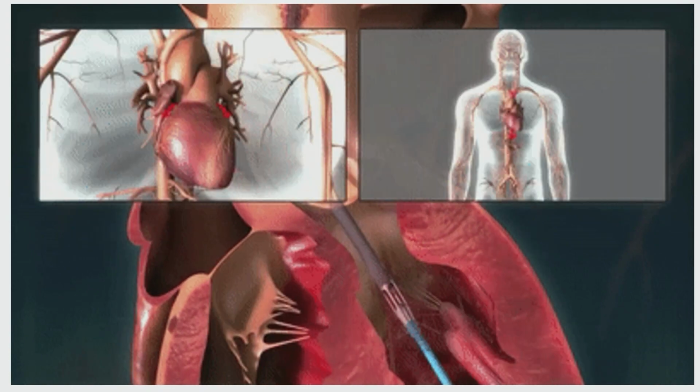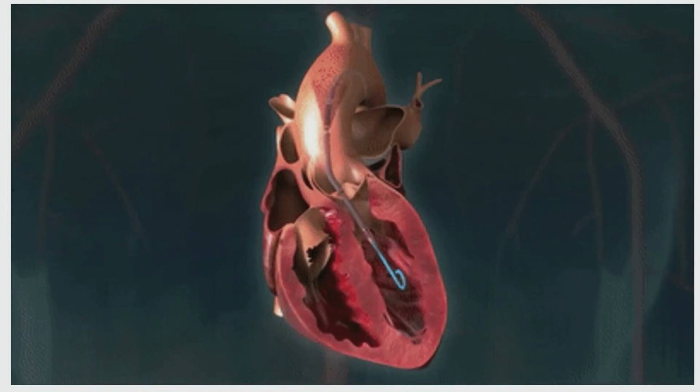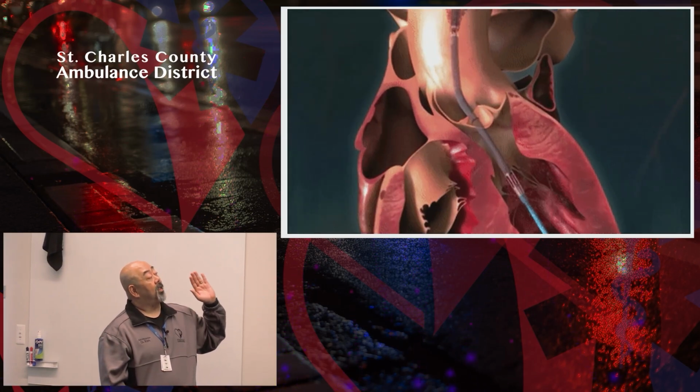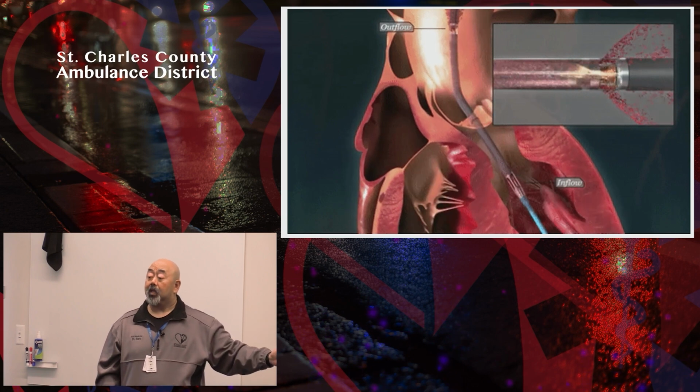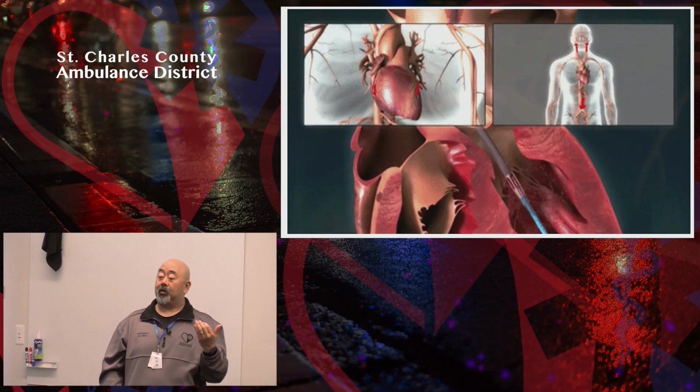And that little motor, pretty powerful. It helps to increase coronary perfusion, but also helps to increase cardiac output. So it directly unloads the left ventricle, typically because the left ventricle just doesn't have enough oomph to maintain cardiac output. So it's relatively simple to place, much simpler than an LVAD, and it can be done endovascularly.